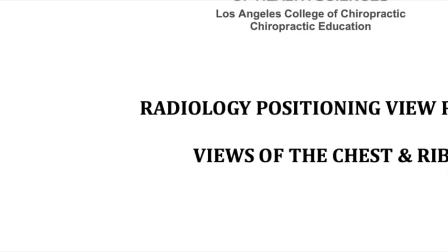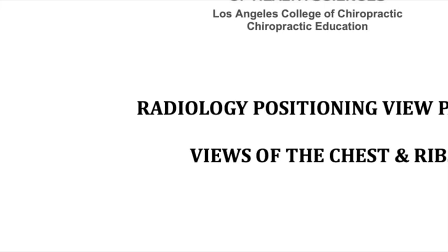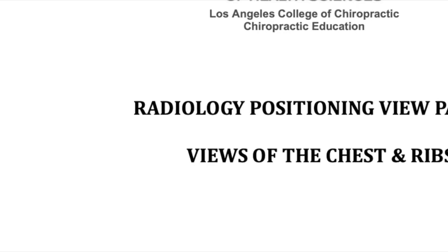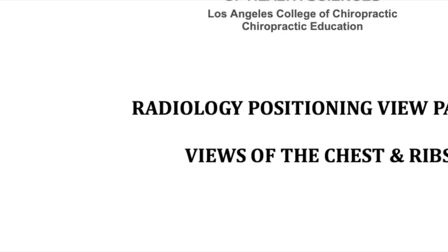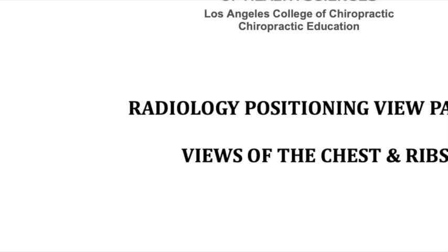The evaluation criteria for a successful posterior anterior chest view include the complete visualization of both lung fields, including the apices and costophrenic angles, with the spine just visible through the heart. Any artifact overlying the lung fields renders the study non-diagnostic.